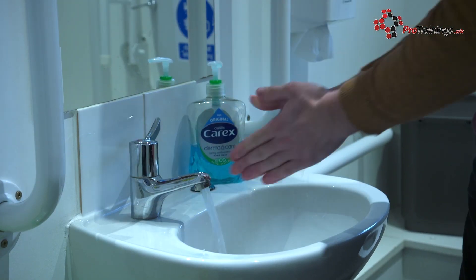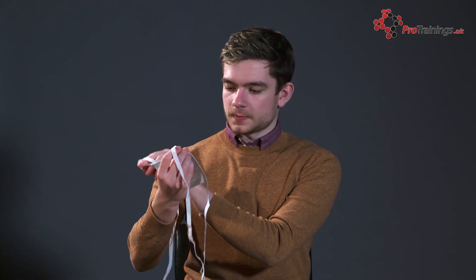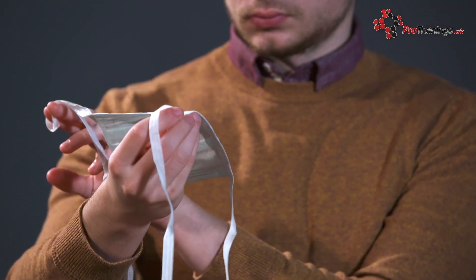Before you apply the mask, you should wash your hands and use alcohol hand gel for at least 20 seconds. Make sure that the mask doesn't have any holes in it or manufacturing faults. If it's damaged, throw it away and use another one.